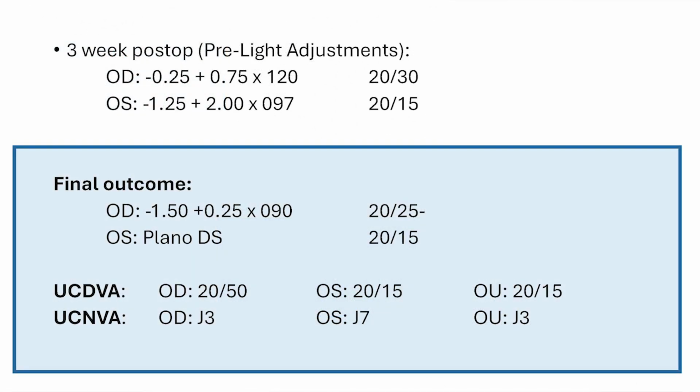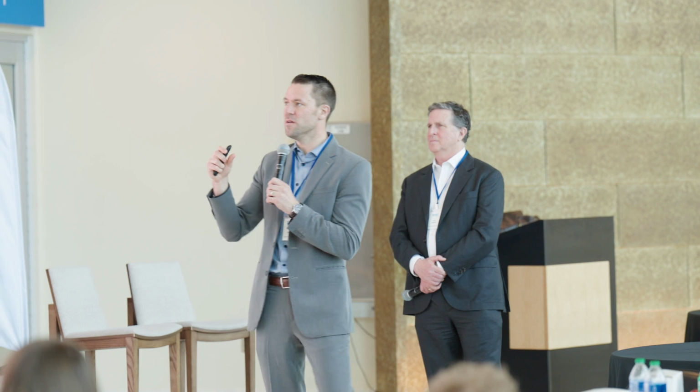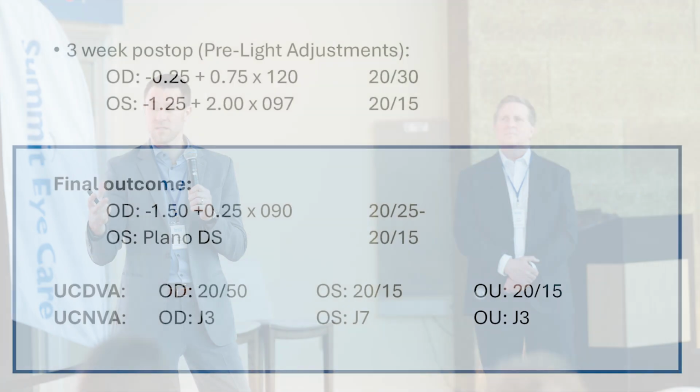So when we saw him before his first adjustment, his right eye, actually the calculations worked out almost exactly what we wanted them to be. His right eye had 3/4 diopters left residual, which is well within the range of what we can do with the LAL. And the left eye, which is his dominant eye, had still 2 diopters. Now, being his dominant eye, and we needed him to have the best possible vision out of that one, understanding that his right eye was still going to be a little bit less, we wanted to get as much possible correction as we could, or at least leave ourselves with enough wiggle room to work with once we got to the light treatments.